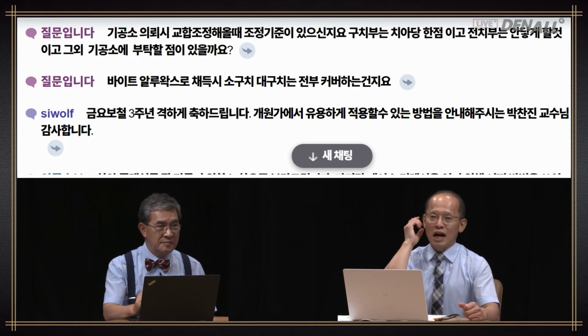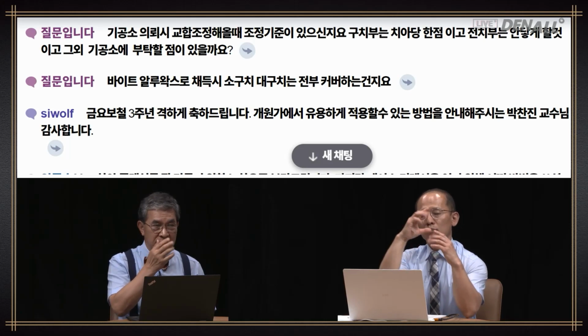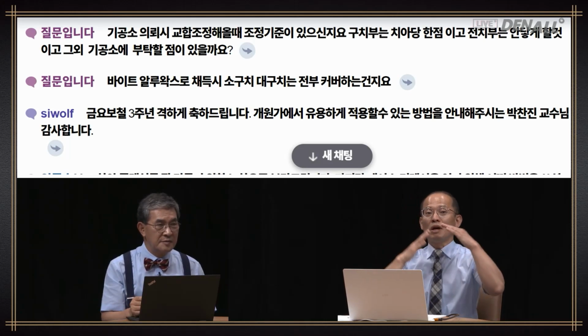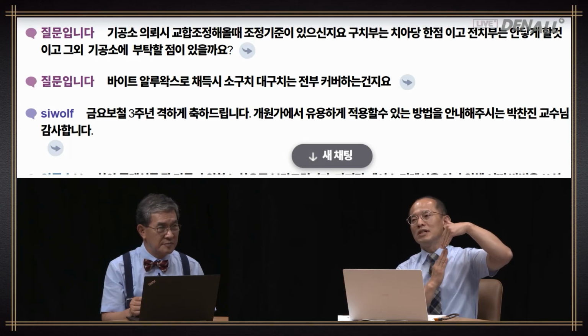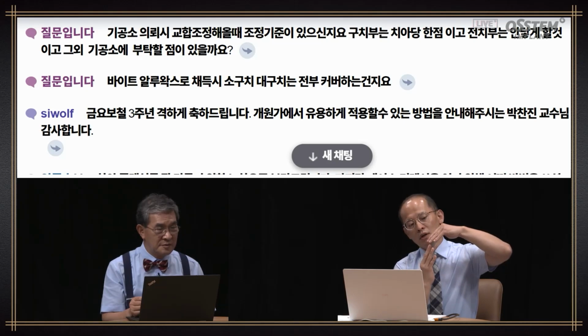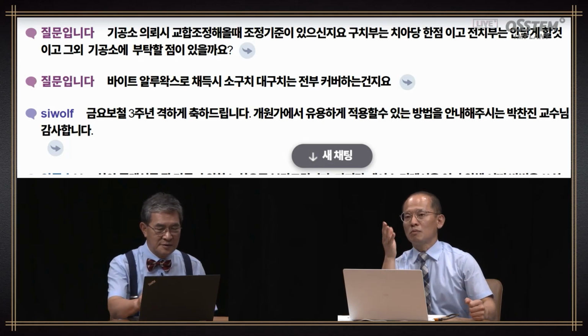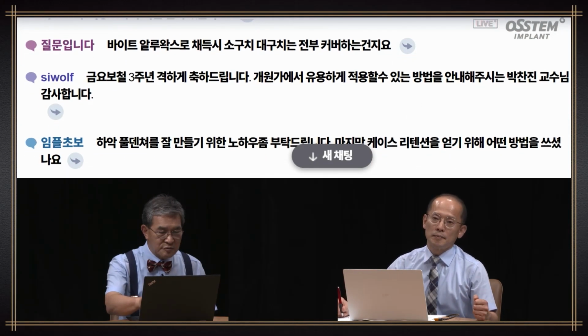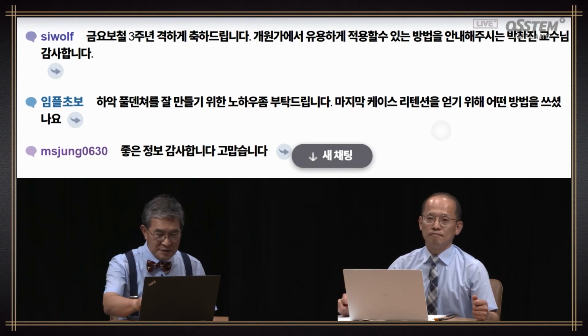Considering all this, on the anterior side, as you say, it should not come into contact. From the get-go, with the teeth arrangement, I always set the vertical overlap to 0 because after adjustment there's always more overlap. So I start with 0, and over that, 1.5 is my starting point. Even then, if there's a shift, the overlap becomes tighter. So ultimately, as you said, anterior, you have to have no contact. And you have to cover the premolar and molar, right? Okay, yes, of course.